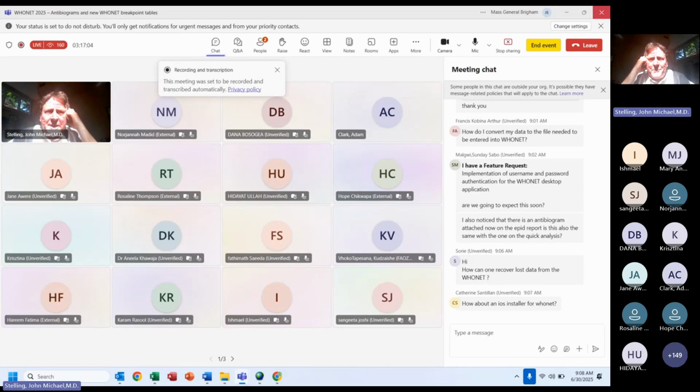The second advantage of the network is hospital or laboratory. I say hospital, but I mean any laboratory, like public health lab, veterinary lab. The IT people are usually pretty good about backing up the server. In my hospital, we back up every day, maybe multiple times a day, I don't know. Other people are pretty good about weekly backups, monthly backups, and not great, but it's something. So backups, the main strategy is to make sure you have a backup copy saved.